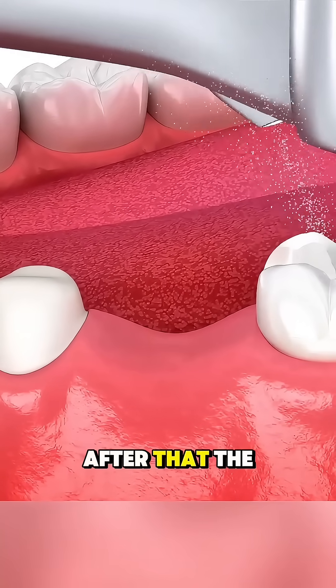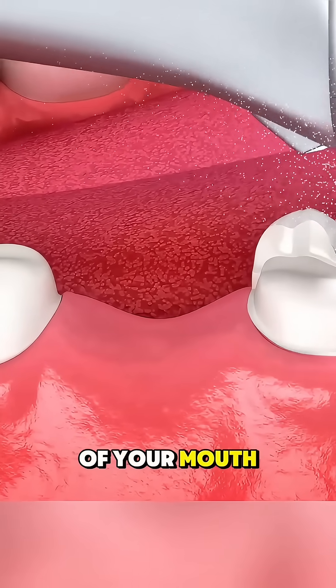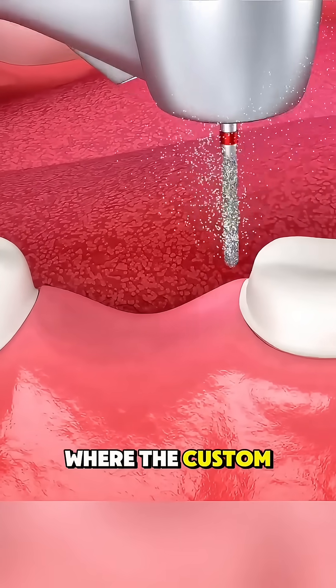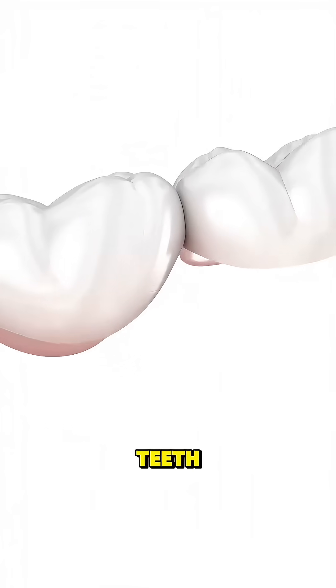After that, the dentist takes a precise impression or digital scan of your mouth, which is sent to a dental lab where the custom bridge is created to match your bite and the natural look of your teeth.